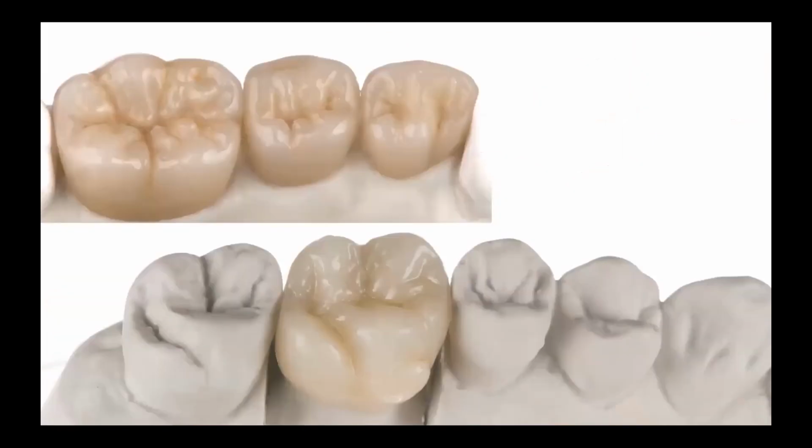And please have a look. The single molar was finalized only with the help of glaze and stains. And for these three units in the upper picture, I use this technique with micro layering of whitish opalescent enamel. If we take a close, precise look at the fourth of the molar, we can see that there are some areas where we can't see the previous sharpness anymore, because the glaze slightly influenced the level of individualization of this crown. But if we look at our restoration that was finished with the help of whitish opalescent enamel, we don't have such a problem.